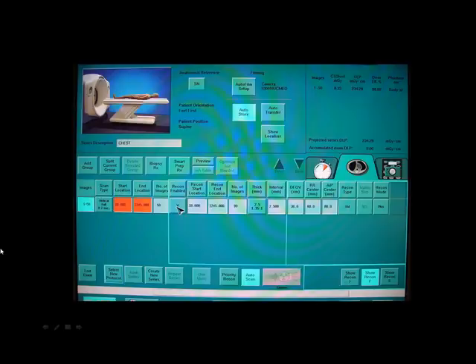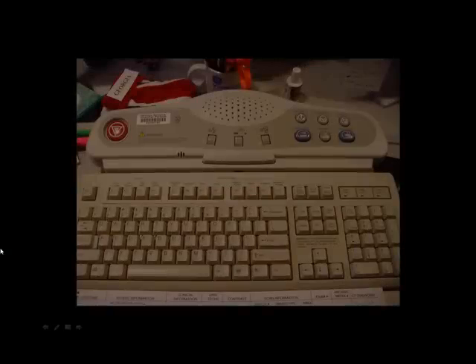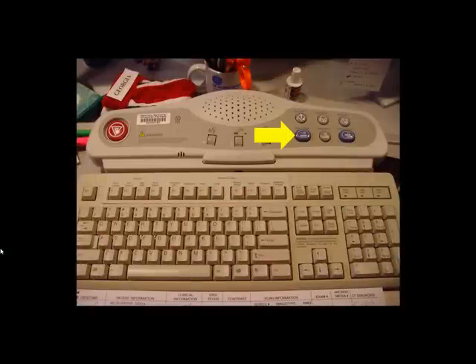You're going to click on the body part. It's going to open up this screen. You're going to click on Show Recon 2 down the bottom right. That's the highlighted button. And over where the arrow is, under Recon Enabled, you're going to turn it on. Most of the time it's set for what they want you to do. This one is in order to do the coronal reformations. Here's your keyboard, your Move to Scan button, your Start Scan button, and again, you can view your images on abdomen.